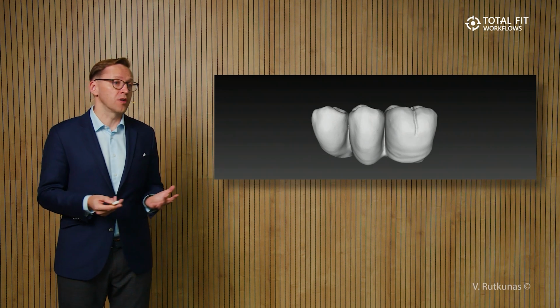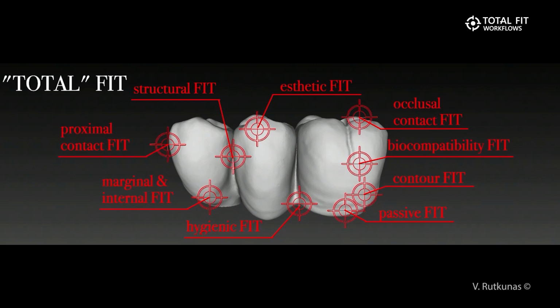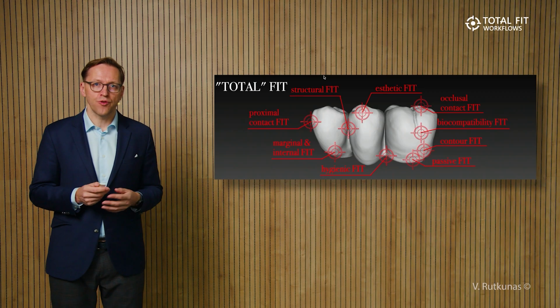Unfortunately, no, because there are so many other criteria for the fit. It's not only the passive fit, but also the proximal contact fit, occlusal fit, the contour, emergence contour of the restoration, cleansability of the prosthesis. So there are so many fit criteria for our implant supported restoration.